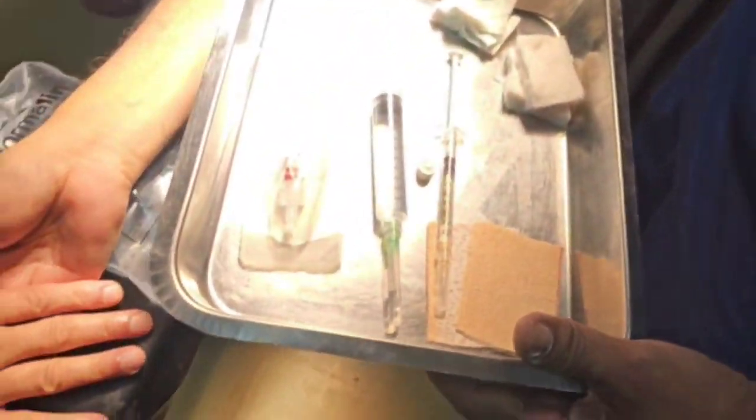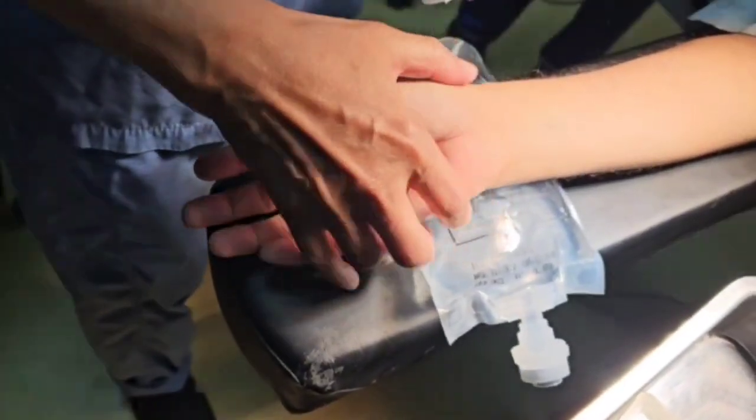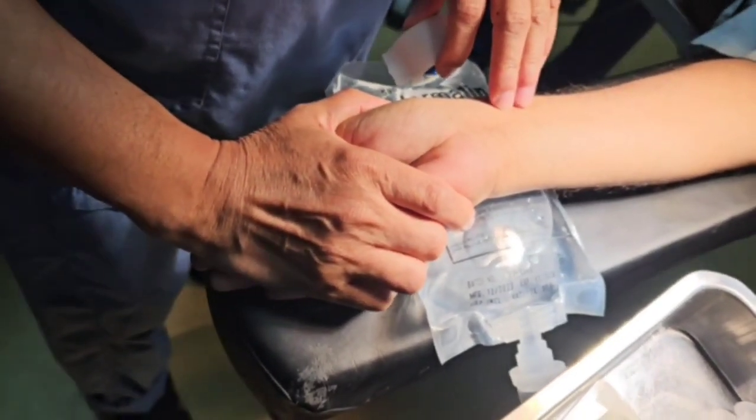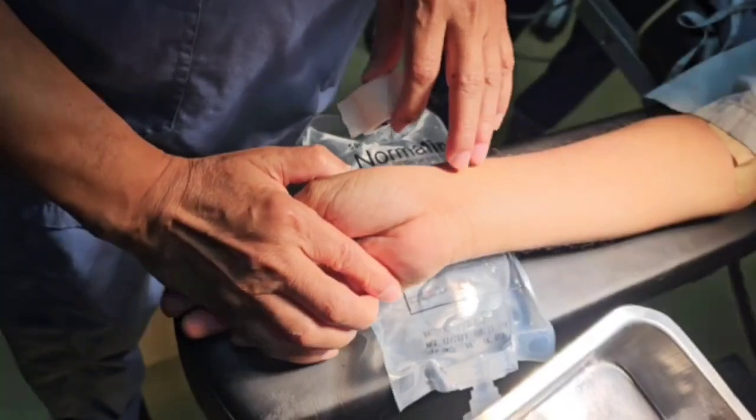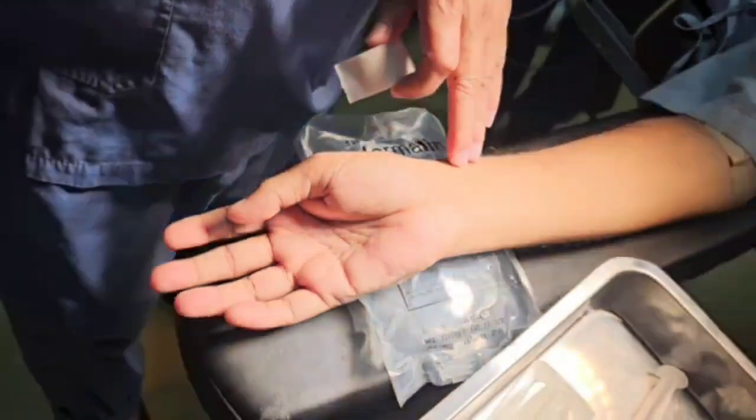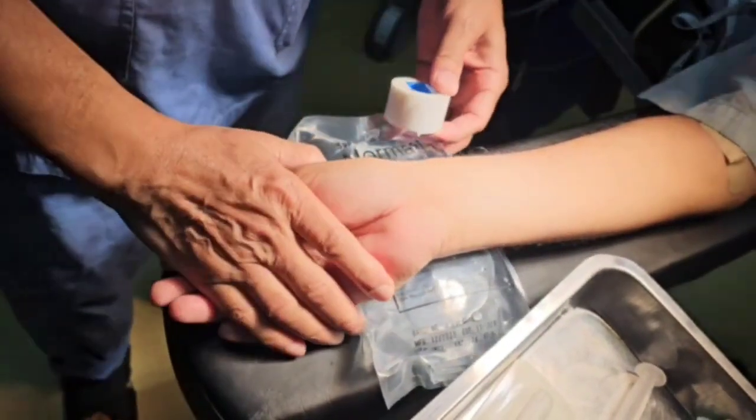Hello dear viewers, welcome to your favorite channel Organ Babu. Today we are going to talk about radial arterial line placement. For arterial line placement, we firstly need to position the forearm and wrist, then maintain the position by placing a saline bag under the wrist and securing the fingers with tape.